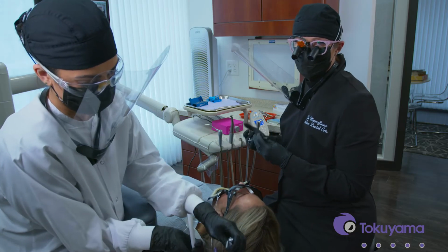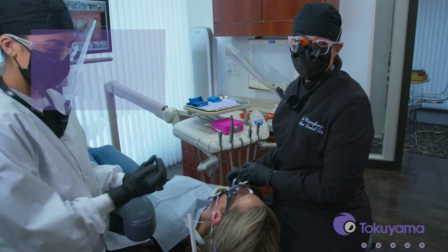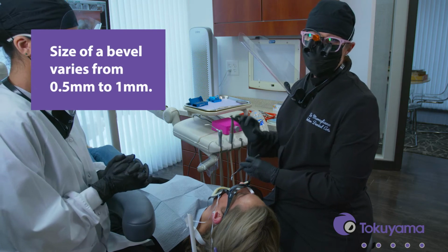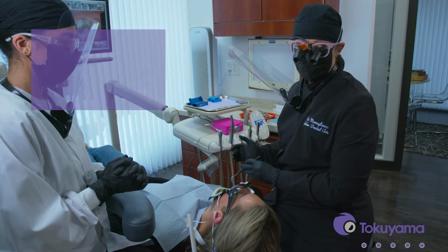You might be wondering how big of a bevel that I consider placing. It really depends on the preparation. I obviously always try to err on the side of being minimally invasive. So generally my bevel is about 0.5, sometimes a millimeter if I have the space, but I really just try to roughen up the enamel around the preparation for better bonding.